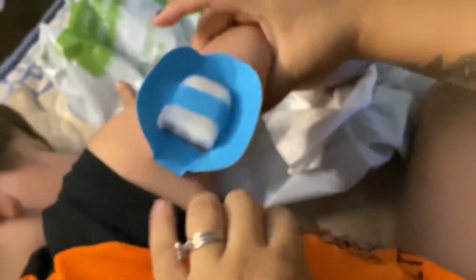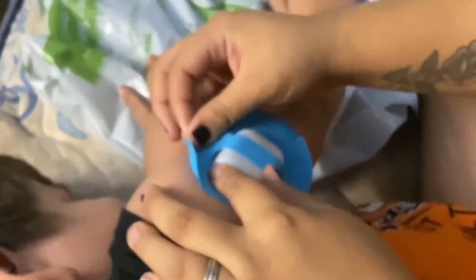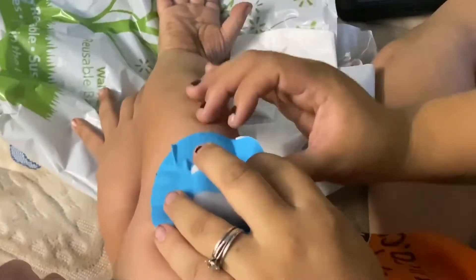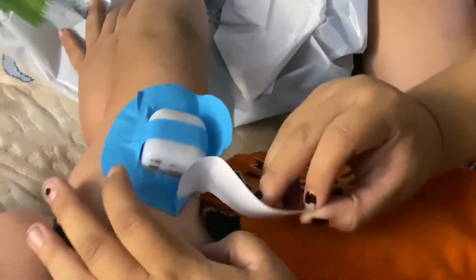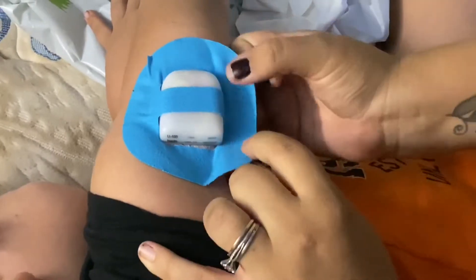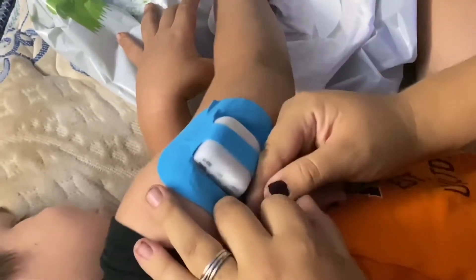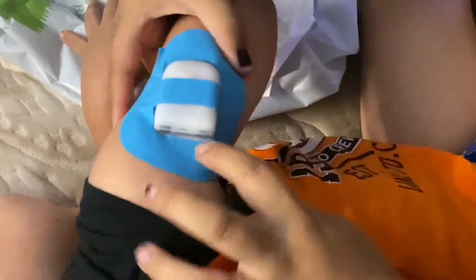I put it on like that and just kind of pull it in. This is a little bit higher up so it will feel a bit different at first. There we go — and then just this part. That one wraps around a bit. There we go — and that is not going anywhere. All done!